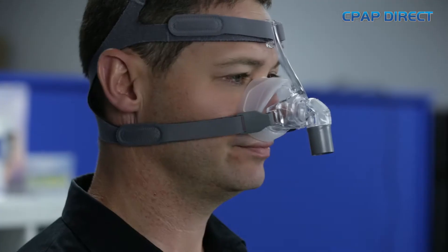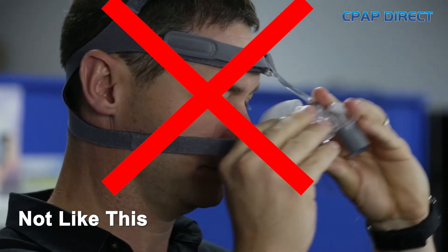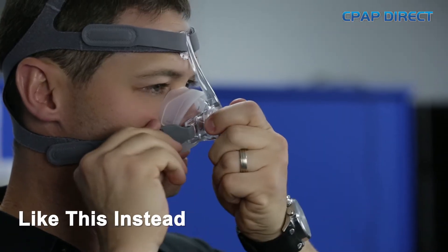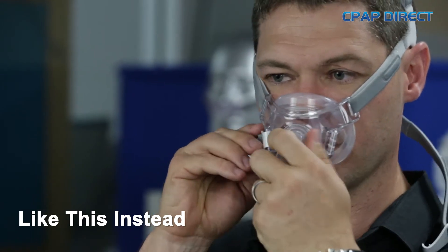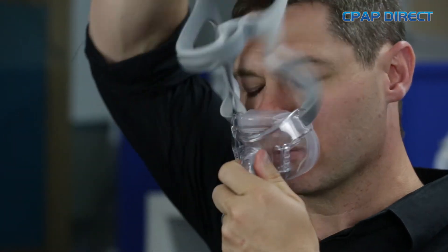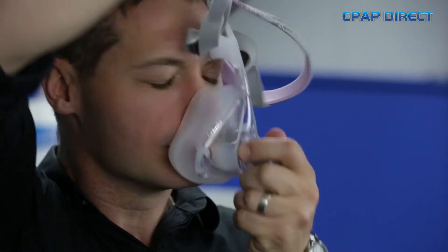Many people come into the stores and they say that their headgear is not lasting and the Velcros are losing their stick. And that's because they're using the Velcro straps to undo it to take the mask off. The secret is to use the clips on the mask or the hooks to take the mask off, not the Velcro. The Velcro is only for minor adjustments, and if you use them often, they will lose their stick and you'll find that you'll be spending a lot of money on replacing headgear.